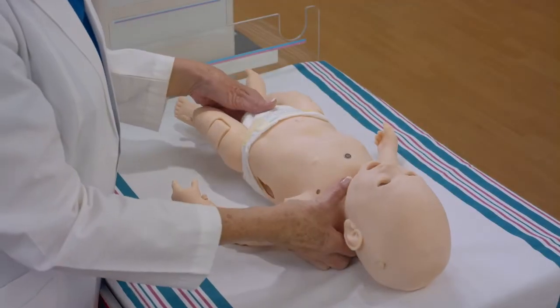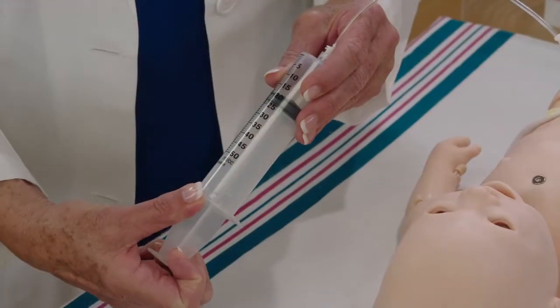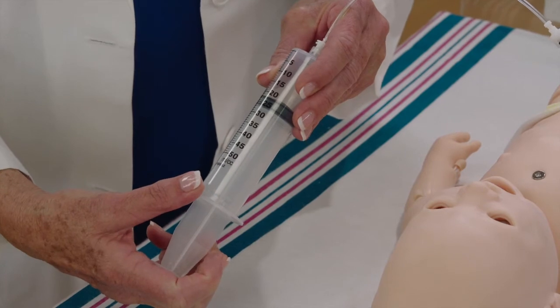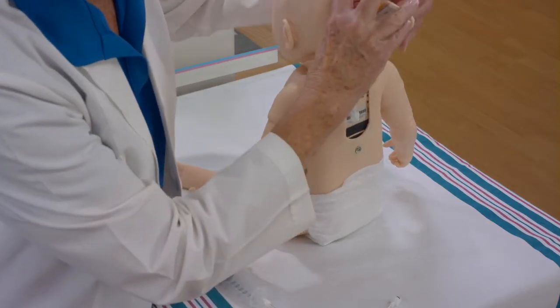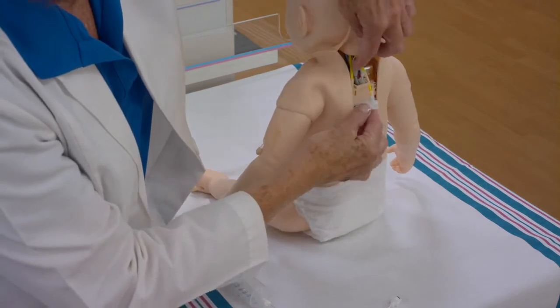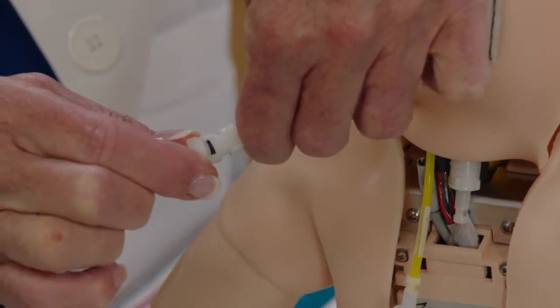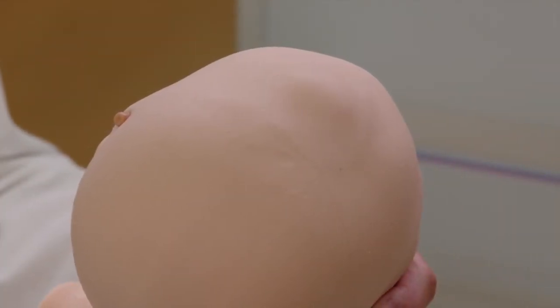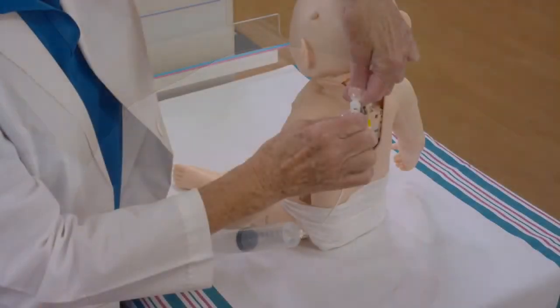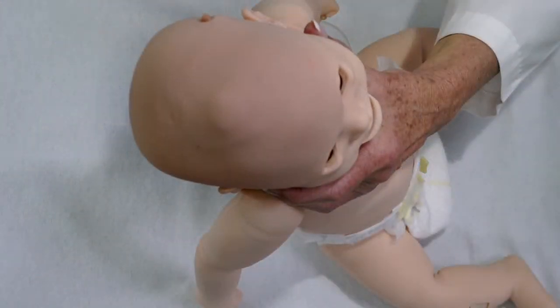Luna has an anterior fontanelle that can be manually activated. To enlarge the fontanelle, pull back on the syringe plunger to have 20 milliliters of air in the syringe. Attach the syringe and tubing to the fontanelle port on the back of the mannequin's neck. Inject air for the desired bulging appearance. Remove the pneumatic assembly from the fontanelle port and the fontanelle will retain the appearance set.